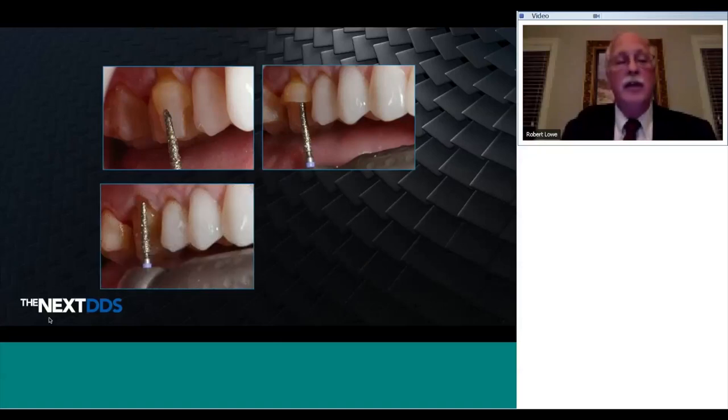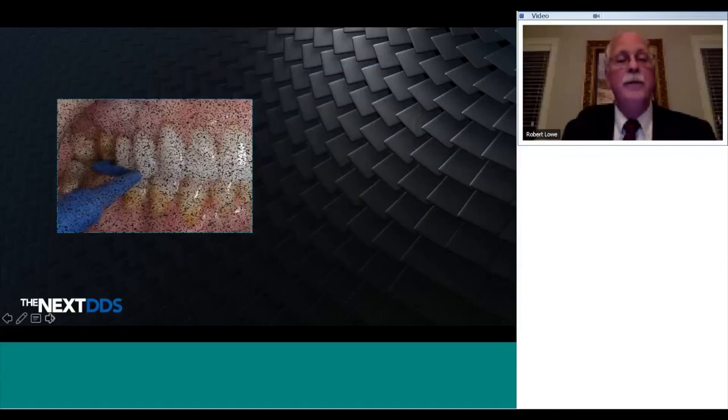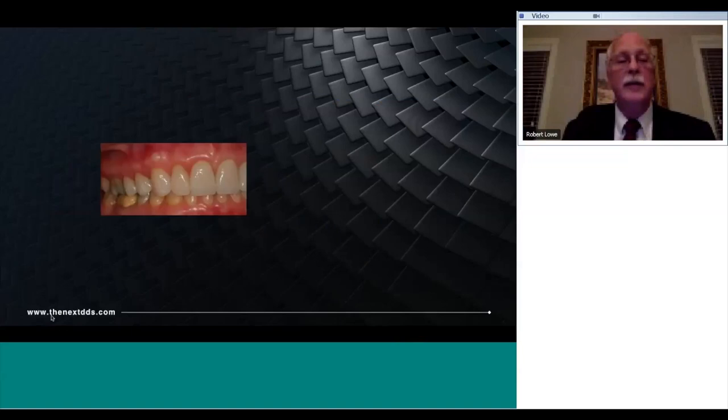I'm going to go a little bit faster here because I want you to see sequential preparation, depth cutting the cervical half or the incisal half first and creating a finish line, which won't be a finish line, but changing the axis of inclination and then preparing the second plane, which is the cervical plane. Using a gauge, this is Prepsure from Contact EZ, to make sure I've got two millimeters of thickness, as the restoration here is going to be an E.max full coverage crown with buildup foundation, as you see.